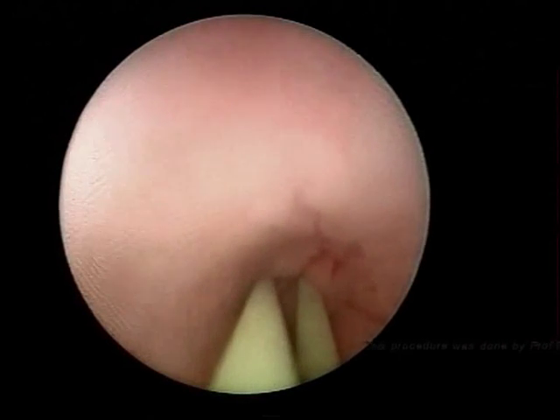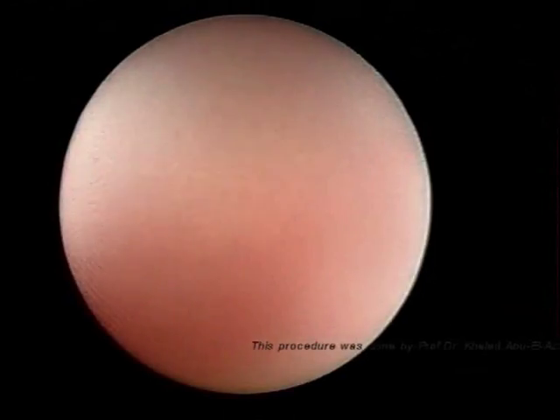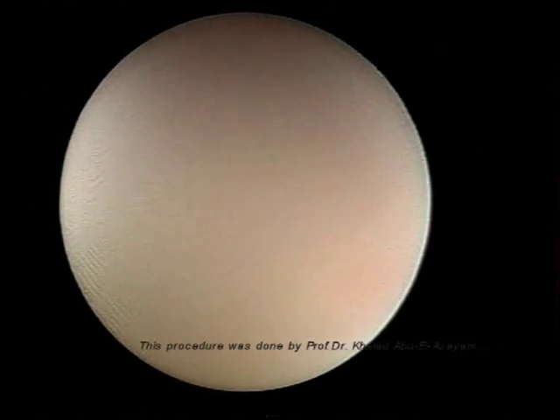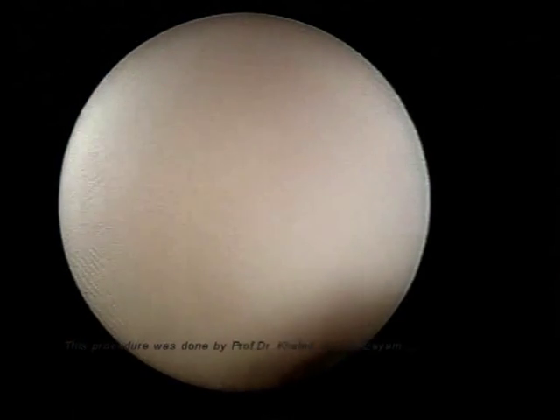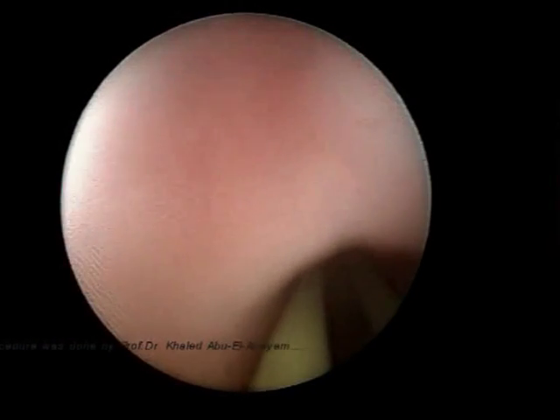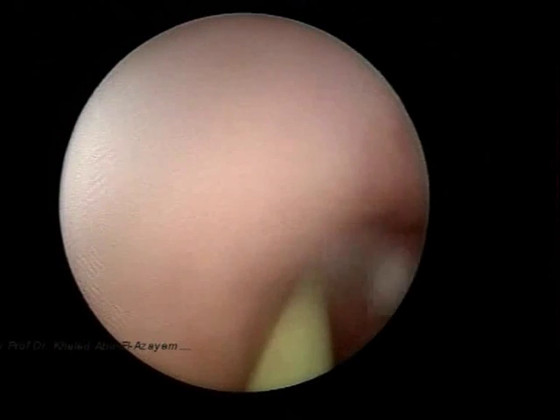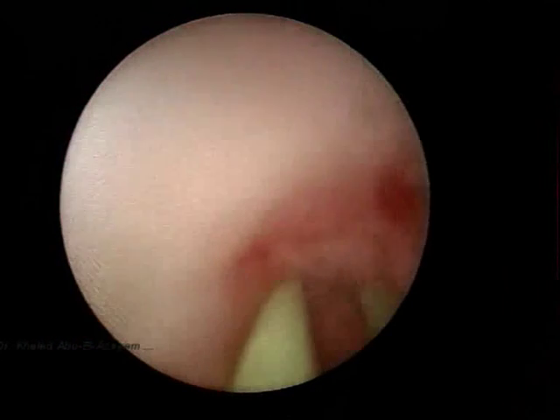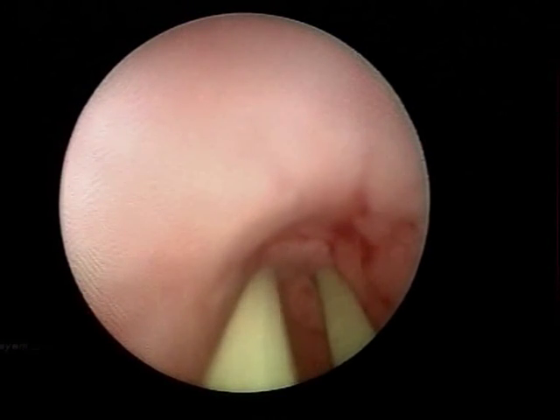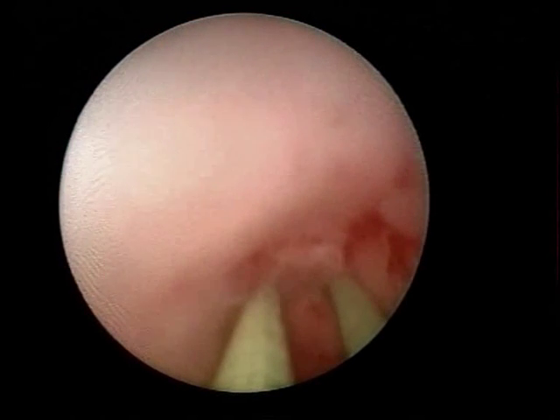Another guide wire is inserted through the ureteroscope working channel to guide the ureteroscope through the obstruction site. But as you can see, it is still very difficult to bypass the pelviureteric obstruction site with this ureteroscope.